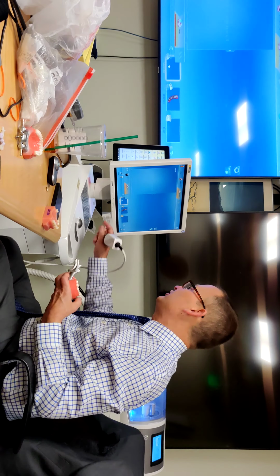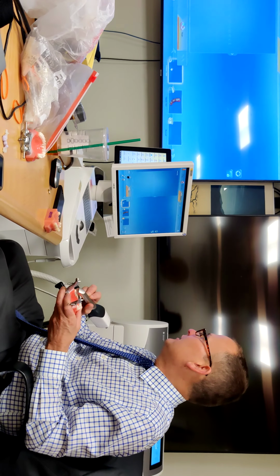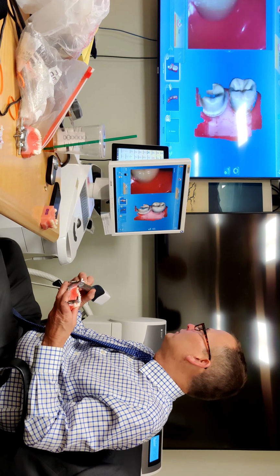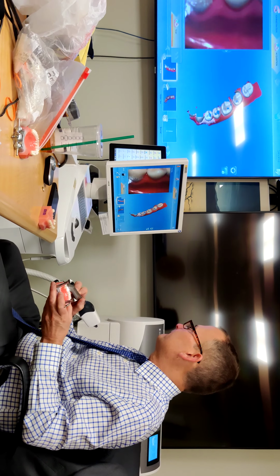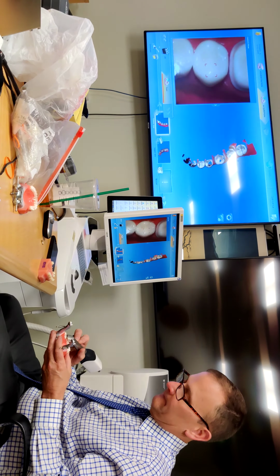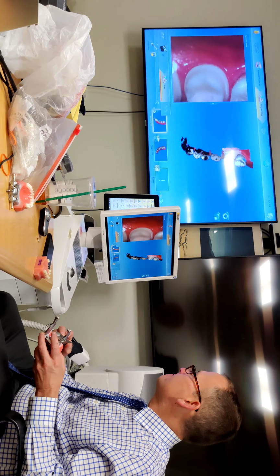So now I'm going to go to the opposing. That's a great question. Thanks, Doug. I'm going to go to the opposing. Oh, I should have shown you on the bucket.